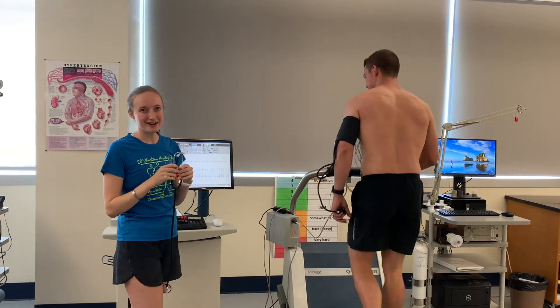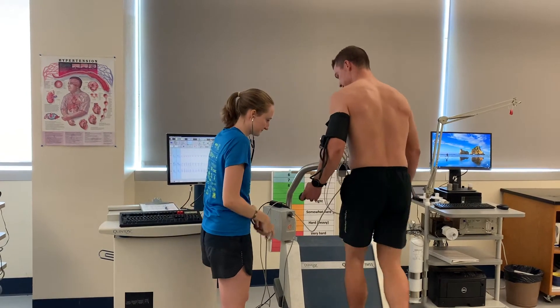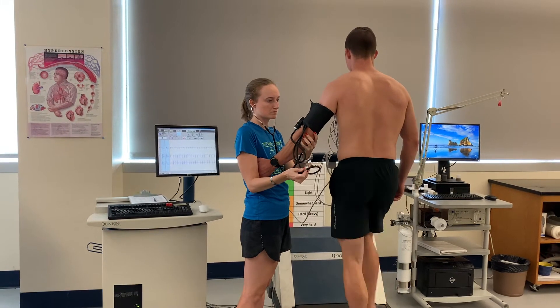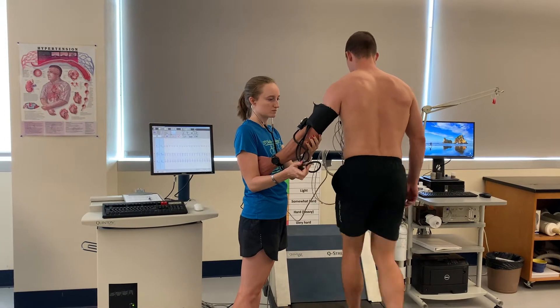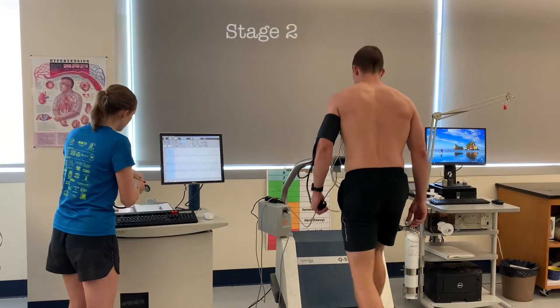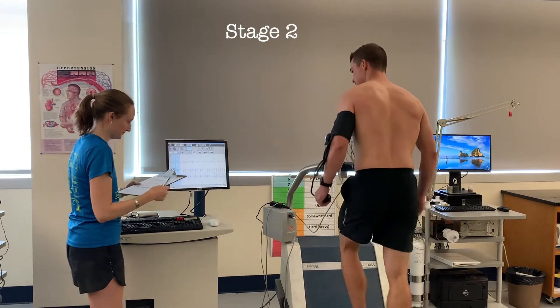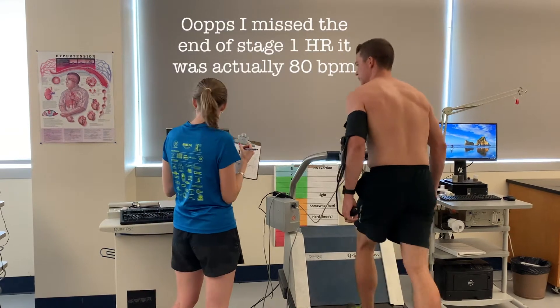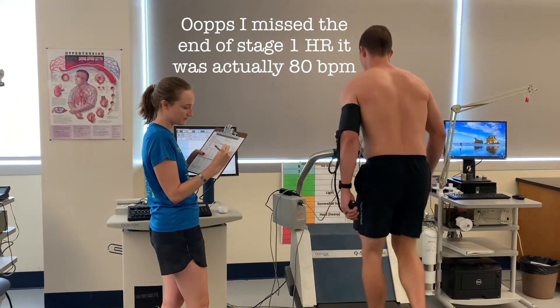We are at 2:20 into stage one, so I'm going to go ahead and start taking the blood pressure. You're at 152 over 82, and you are going up to stage two. Heart rate is 88. What was your RPE at the end of stage one? Eight.